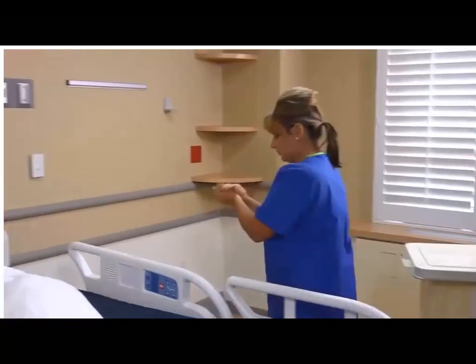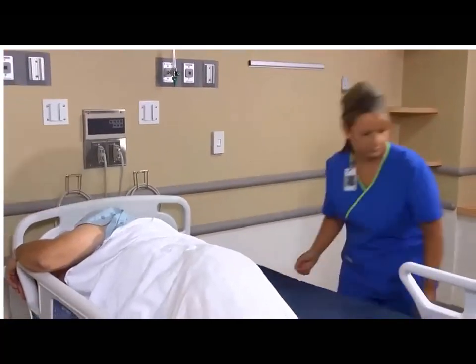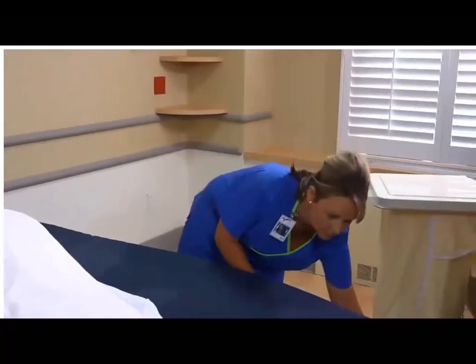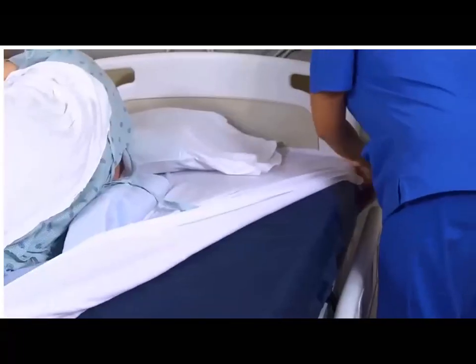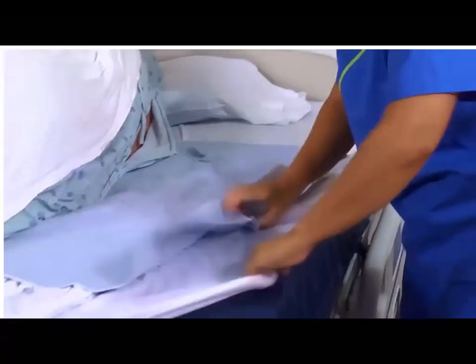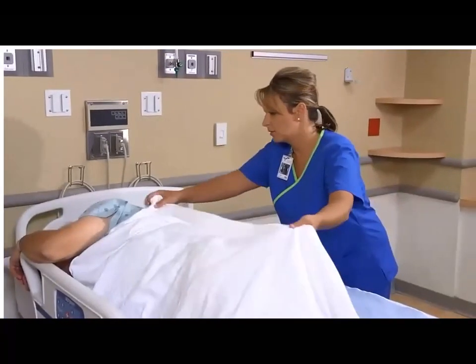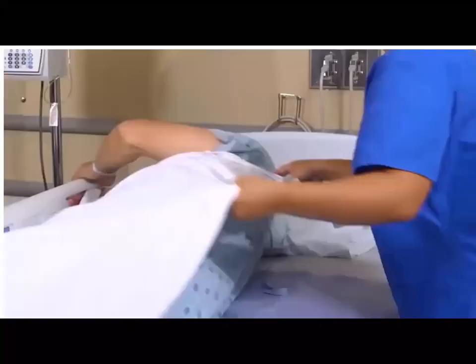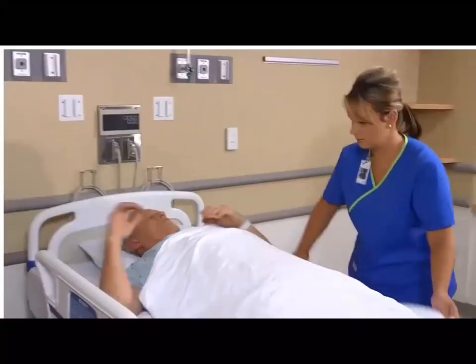Now, lower the side rails and pull the clean, rolled linen and draw sheet or waterproof pad over the edge of the mattress, from the head to the foot of the bed. Pull the corners of the fitted bottom sheet over the edges of the mattress. Then help the patient roll back into a supine position. Okay, Mr. Hayes, I'll have you roll back over to your back. Yeah. You move the pillow over. There you go.